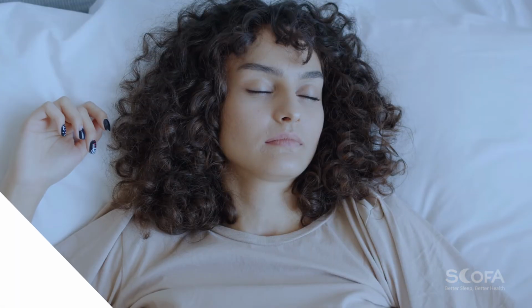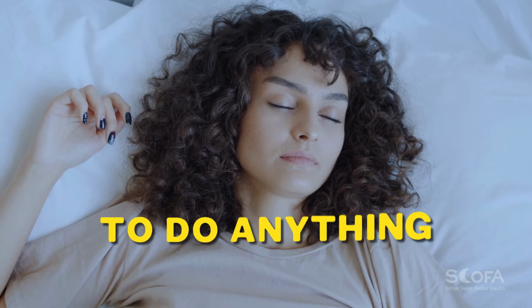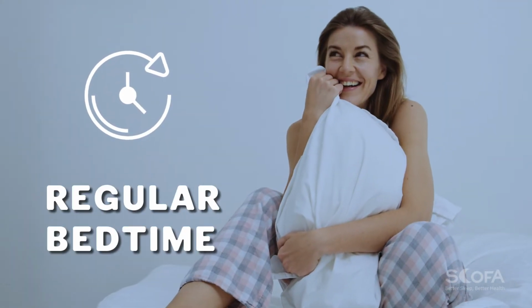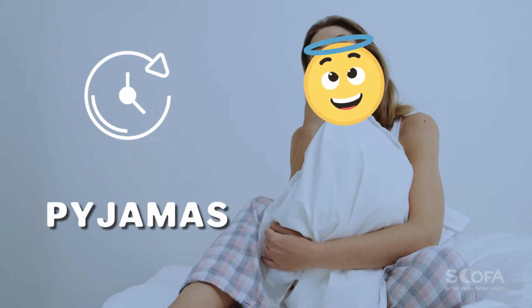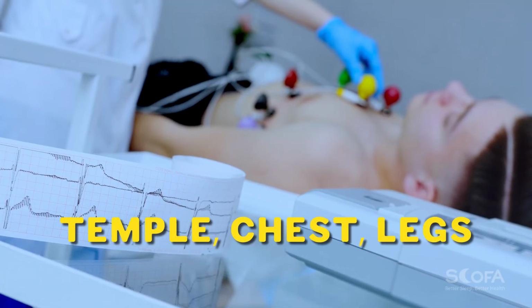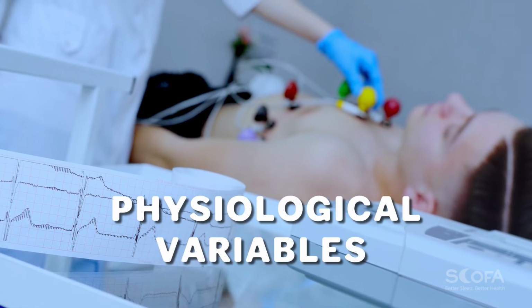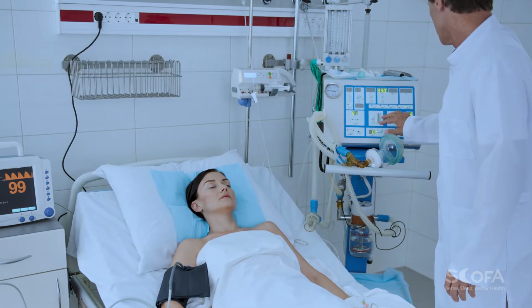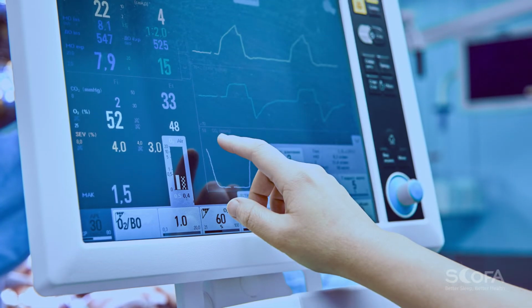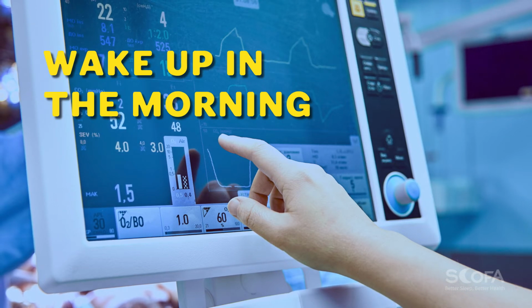Polysomnography. It involves an all-night session at a sleep clinic, and you are not required to do anything out of the ordinary. You are scheduled to come in around your regular bedtime. You can change into your pajamas and come with your own pillow. Sensors will be attached to your temple, chest, legs, and scalp to measure different physiological variables as you sleep. In full-night polysomnography, the test lasts for the whole night, during which a sleep technician will monitor the variables. The test ends when you wake up in the morning.